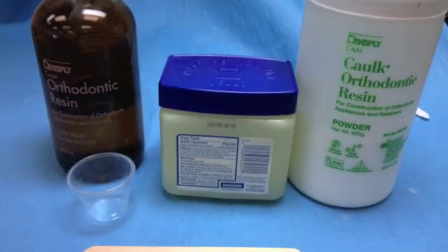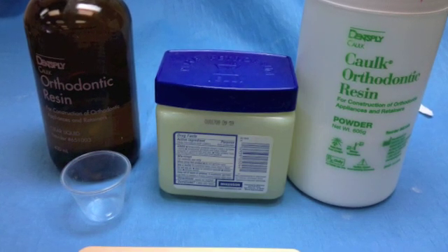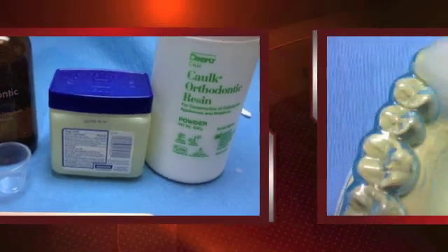The supplies needed include ortho powder, ortho liquid monomer, Vaseline to lubricate your mandibular cast, a mixing cup, and a tongue blade.